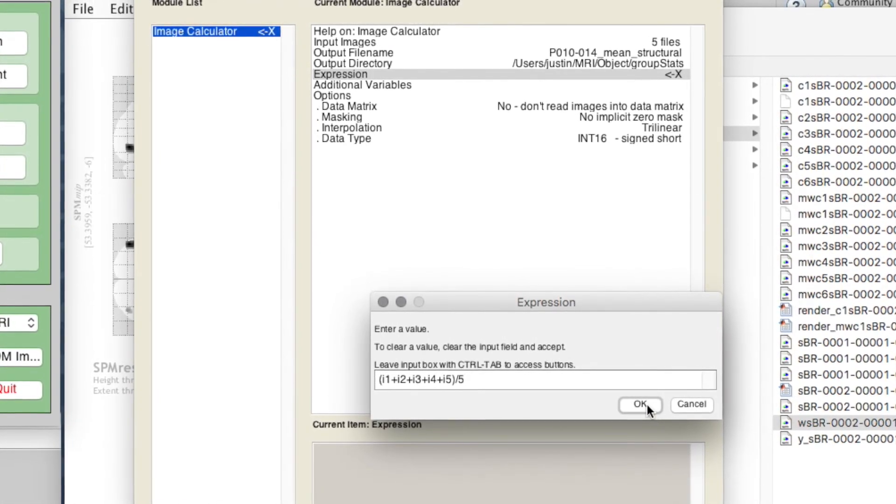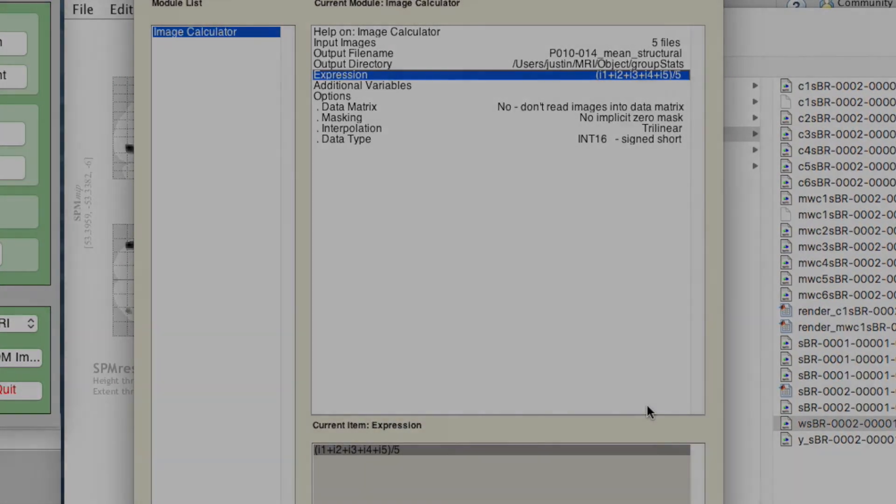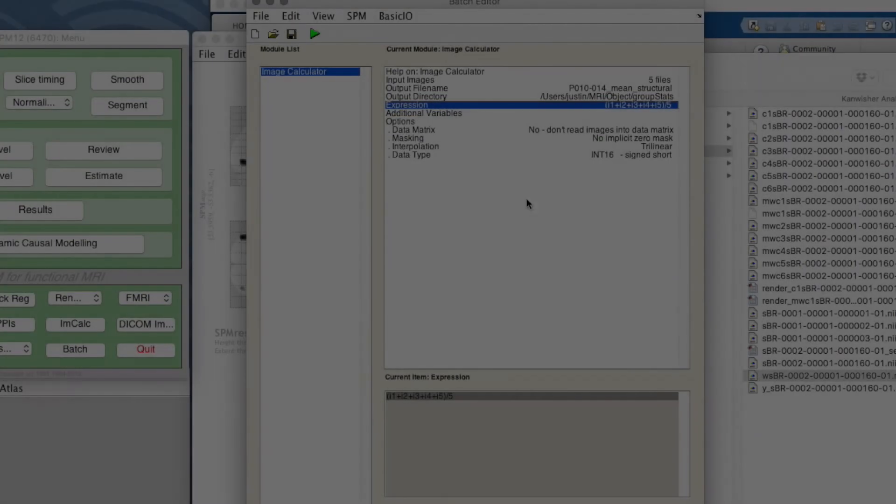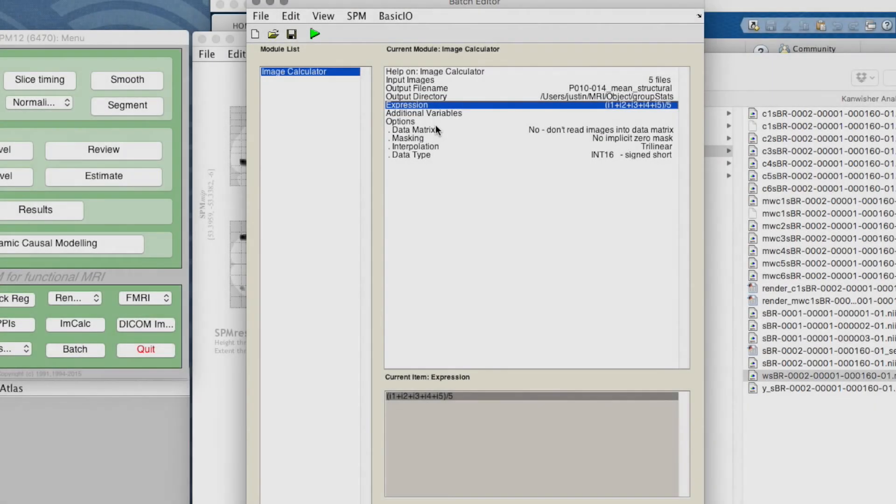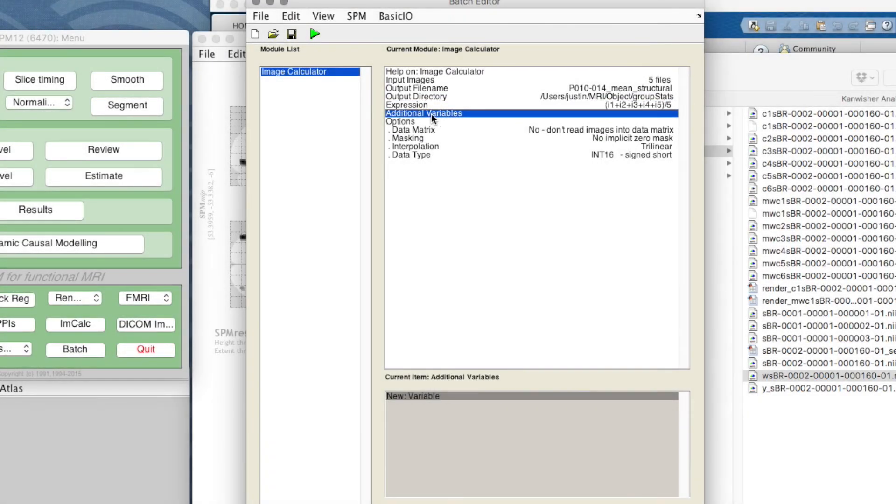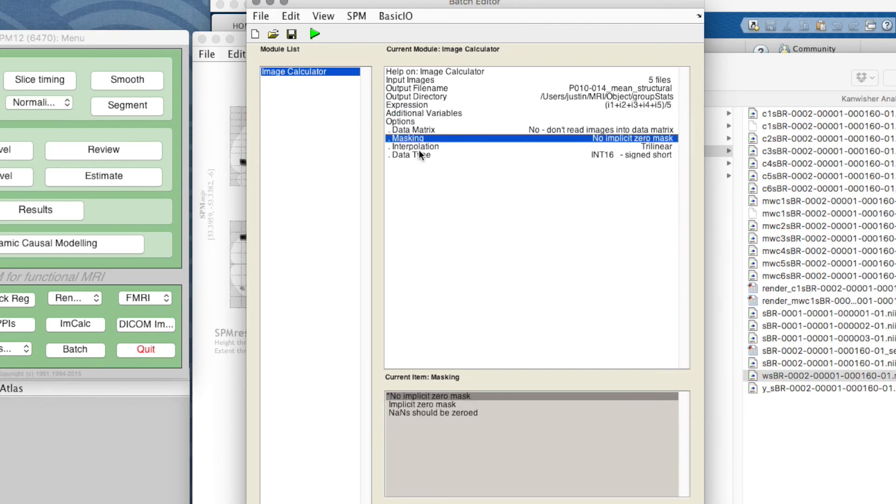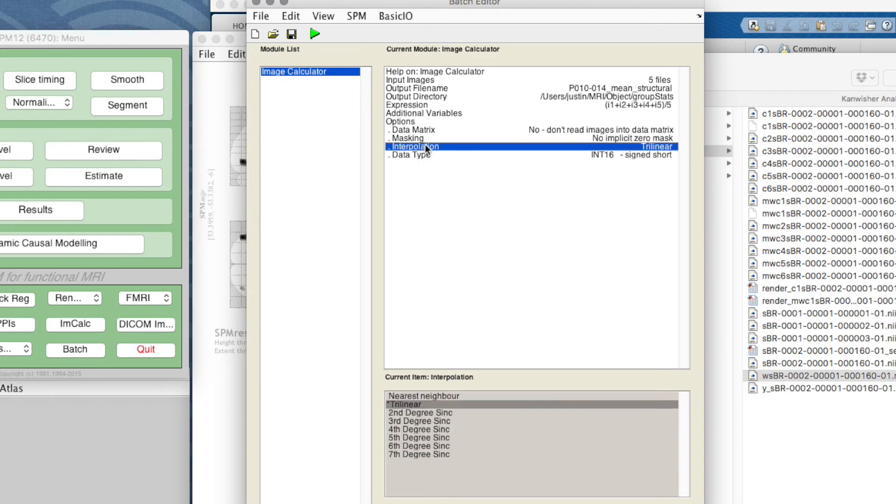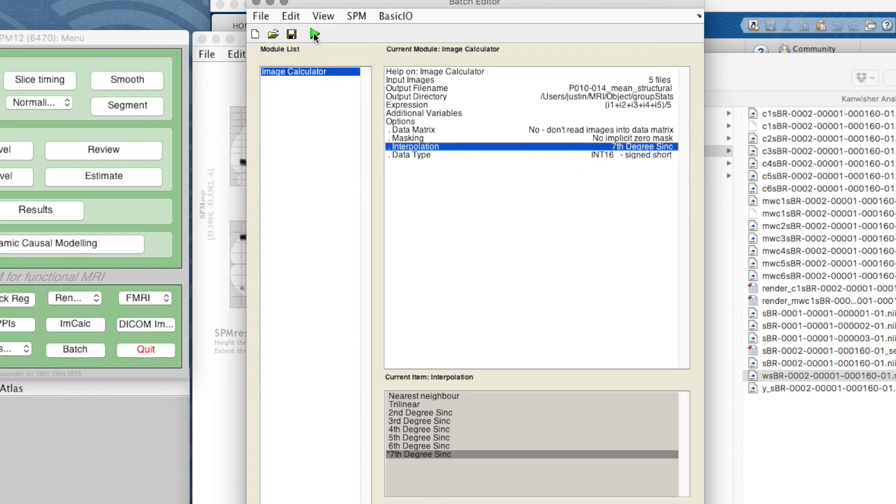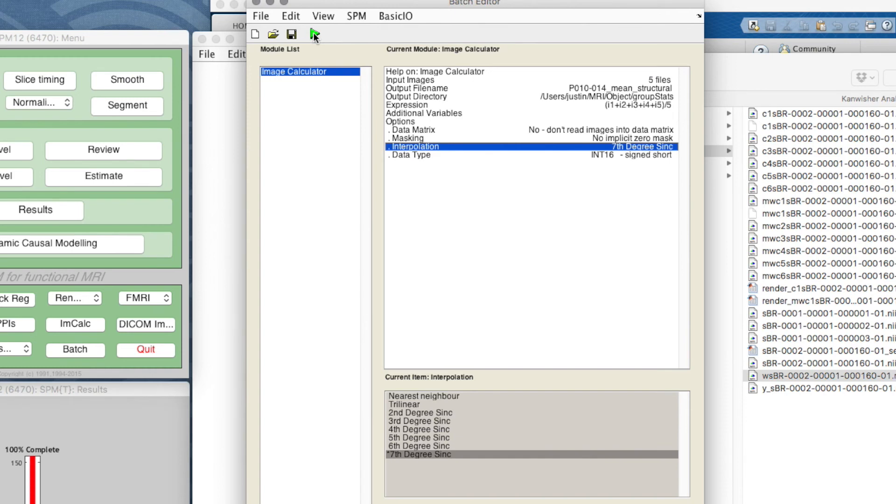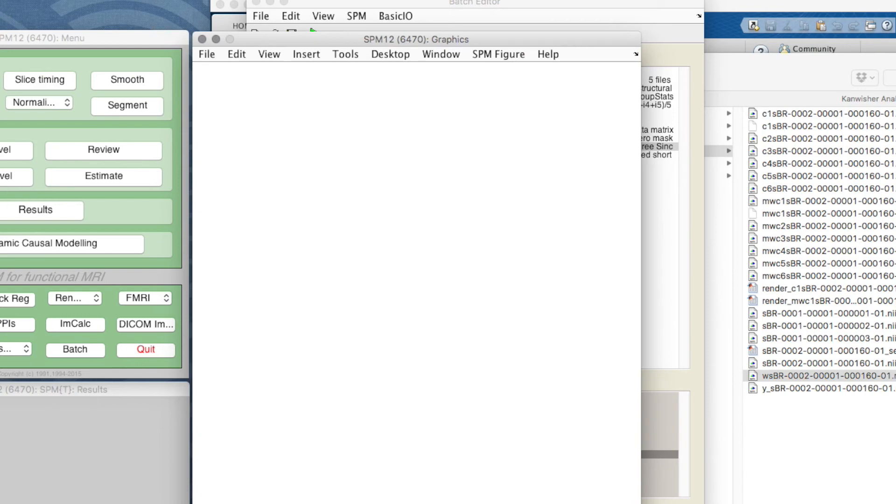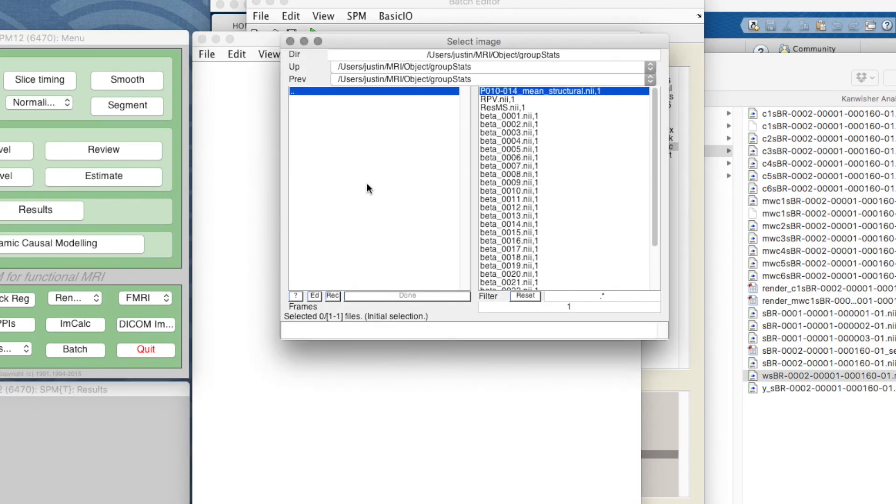No implicit masking, and for interpolation let's do as high quality as possible. Let's quickly run that. It's very quick to do, and now we can see what we've done by clicking on the display button.